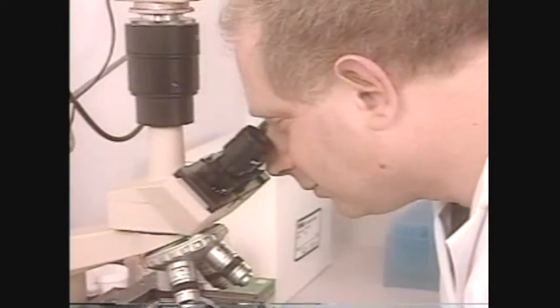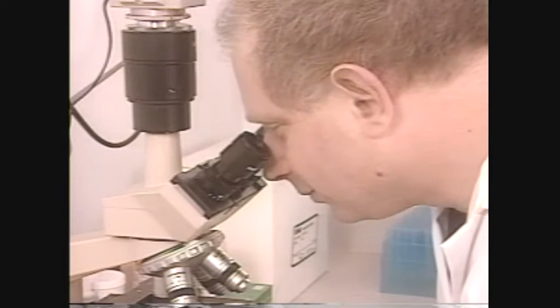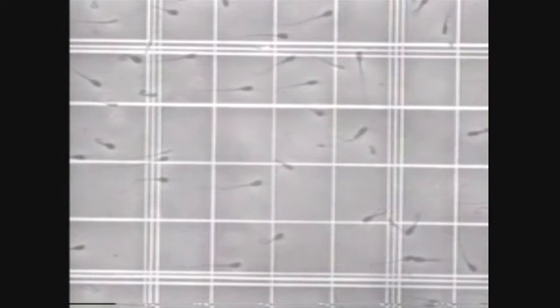When counting individual sperm cells within a large square, work through the 4 rows and columns of smaller squares in a pattern as well, such as starting in the upper left corner and count in a serpentine pattern from left to right. Then down 1 row, right to left, down 1 row, left to right, and so on.